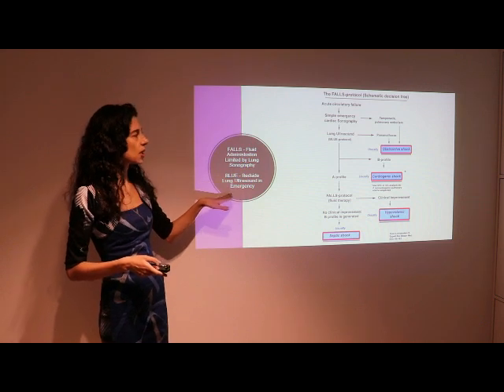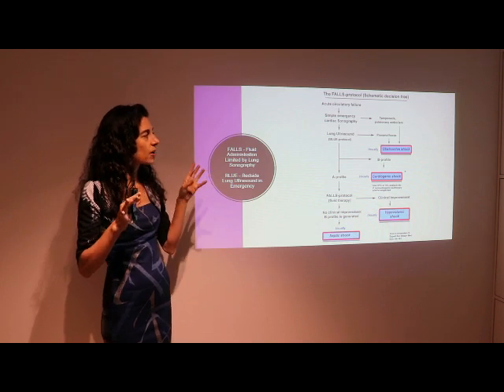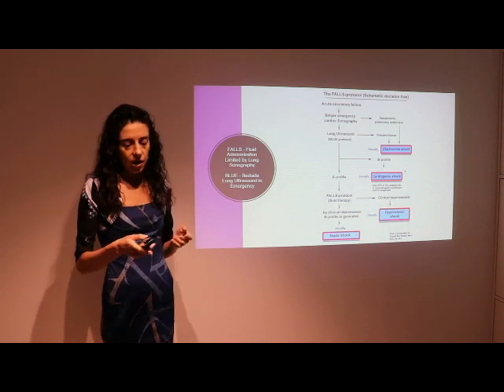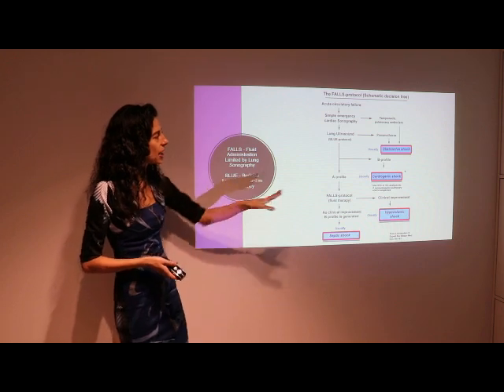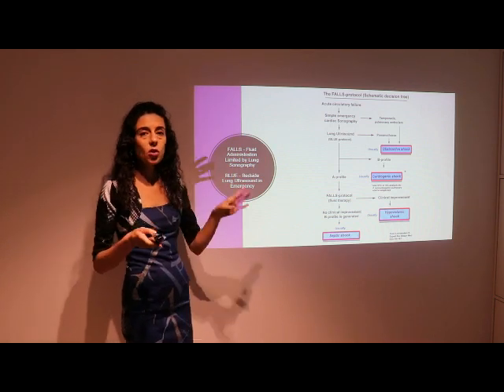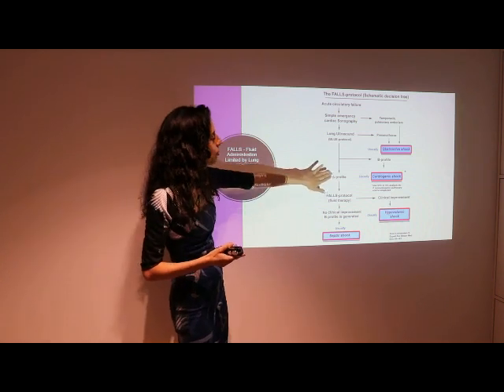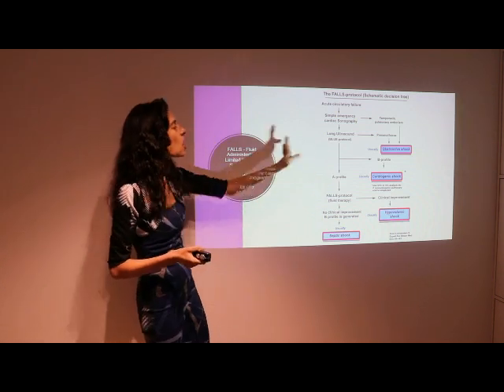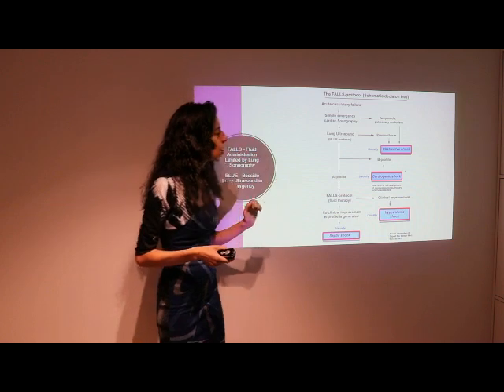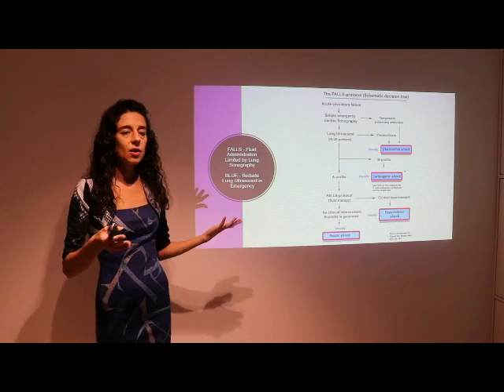And then you get to the lung ultrasound with the so-called BLUE protocol, where BLUE stands for bedside lung ultrasound in emergency. First, you search for signs of pneumothorax. I would get to it a little bit later. If you find this pneumothorax, then it means that again you have the obstructive shock. If you don't find the pneumothorax, then you should define if you have the A profile of the lung of these patients or the B profile. If you have the B profile, usually you have a cardiogenic shock and should treat it respectively.